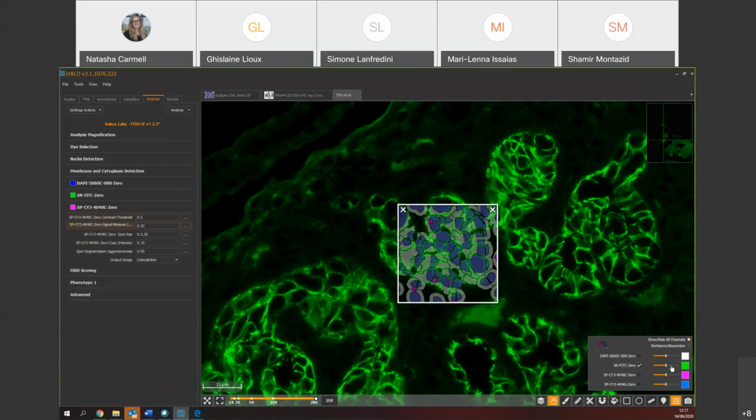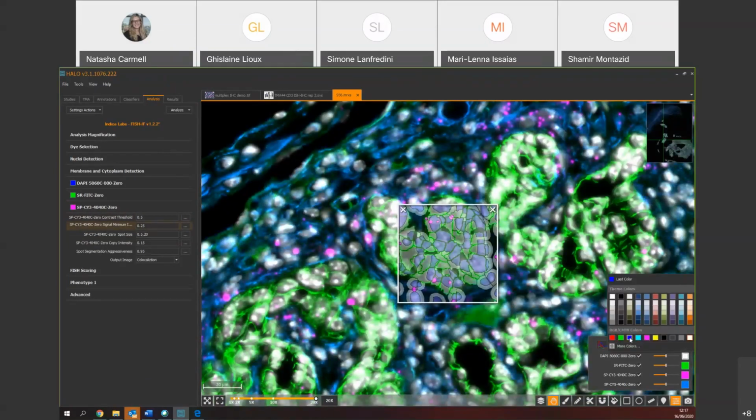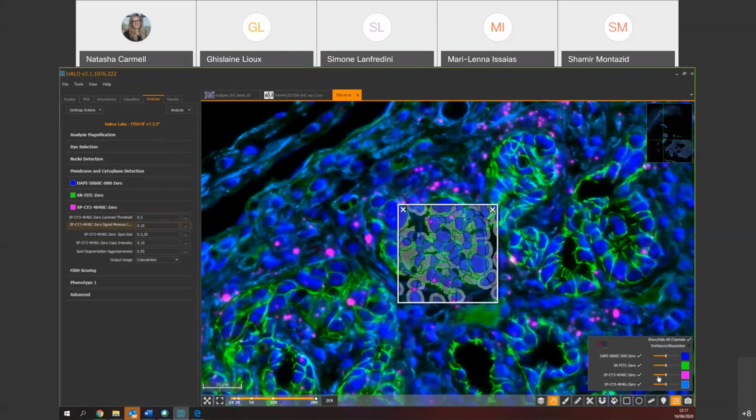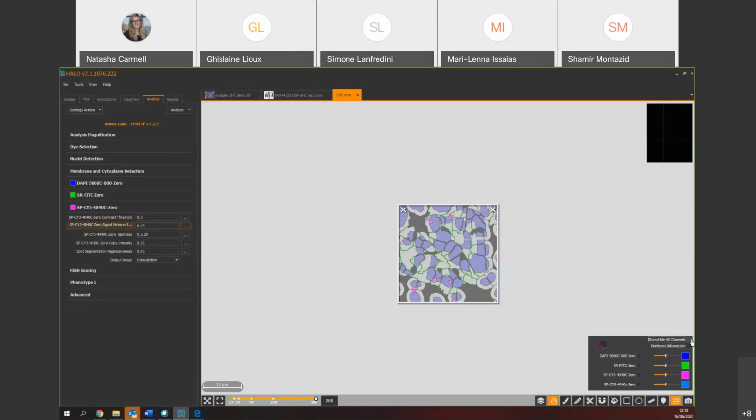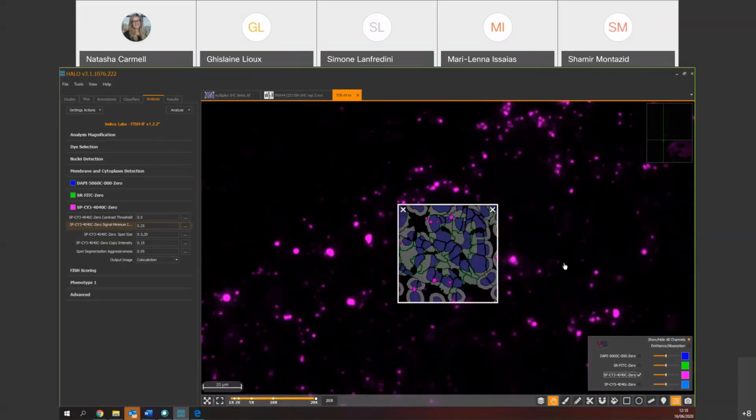And okay, so I'll probably just go back to the image and go back. Okay, I'm just going to set back the tape here and select only my spot channel. Sorry about this. All right, now yes.